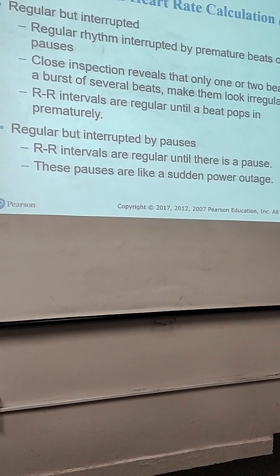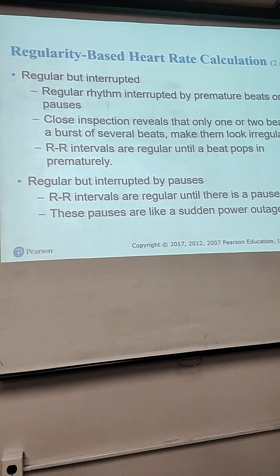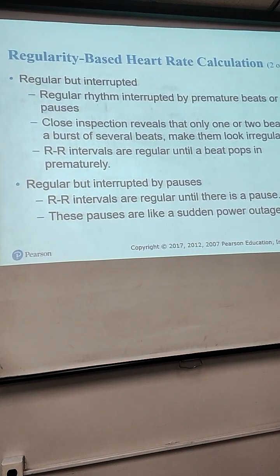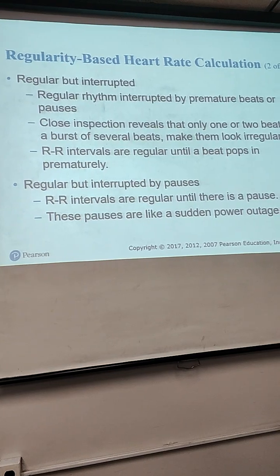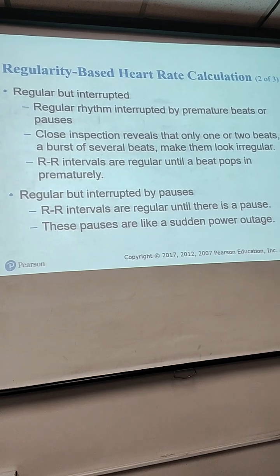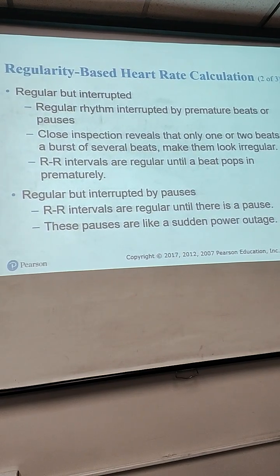The two presentations from the images that I already presented to you have these different types. One is interrupted or premature beats. You're going to see that.